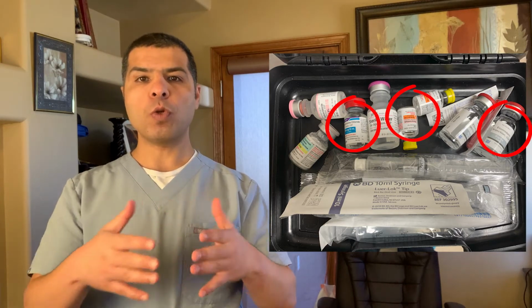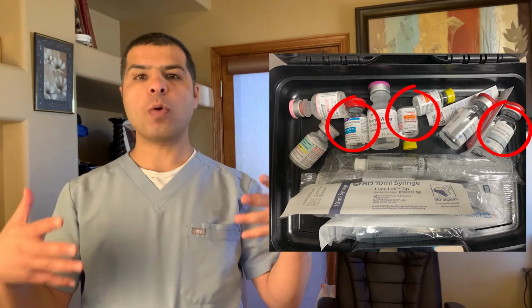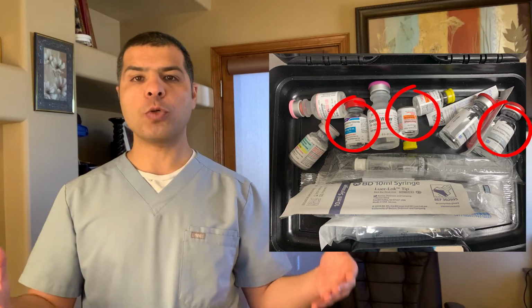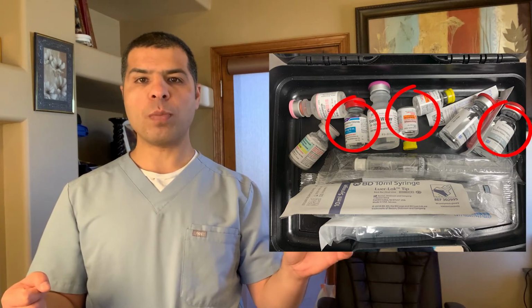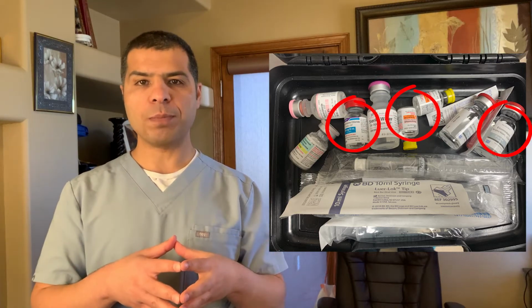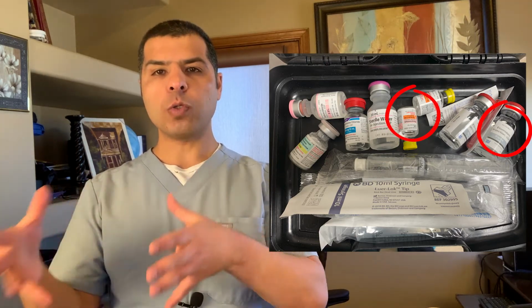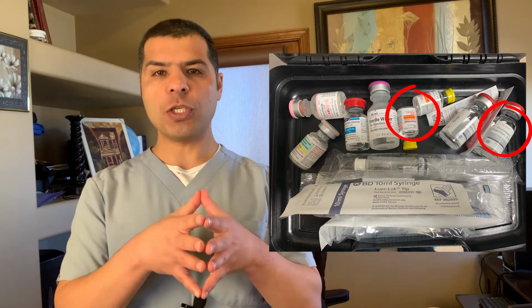So it's very important you know what the RSI kit contains, so you pick a medication that's already in the RSI kit. Now, if you decide to pick something else not in the kit, make sure you order it as soon as possible and make sure they get it for you as quickly as possible. So make sure you ask your pharmacist about your institution's RSI kit and what medication it contains. So I picked etomidate and I dosed it based on his weight, and I picked rocuronium as a paralytic agent. I also dosed that based on his ideal body weight. I told the nurse to get these two medications ready for me.